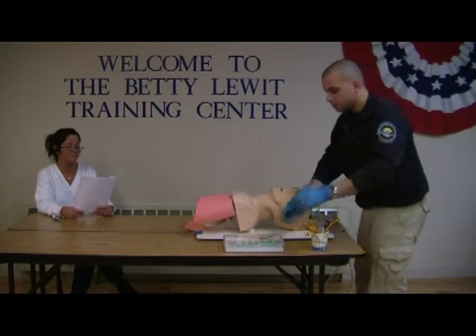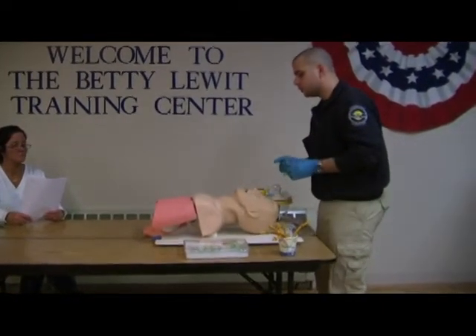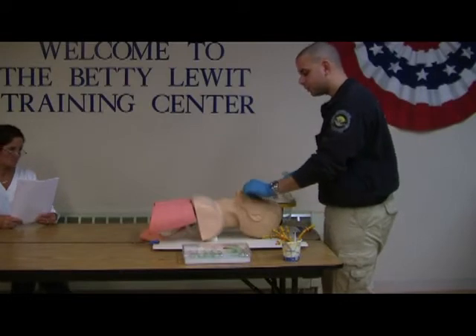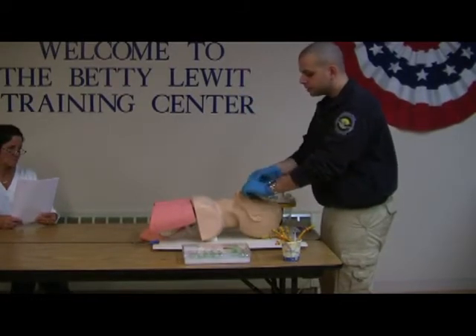VSI in place. I am going to select my oropharyngeal airway. I am going to measure the oropharyngeal airway from the corner of the mouth to the tip of the earlobe. I am going to open the patient's airway with a cross finger technique and insert the OPA upside down, rotating it as I insert.